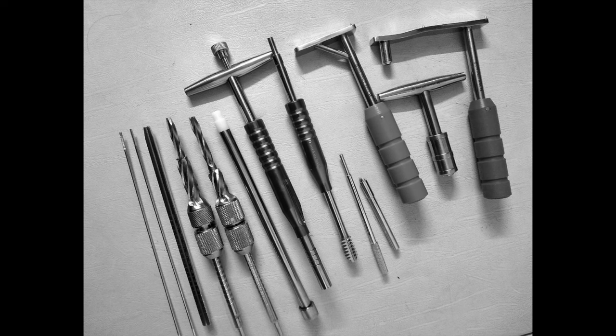Hello friends. Some residents had requested a video on the instrumentation of dynamic hip screw. So in today's video I will be showing you all the instruments that are required for dynamic hip screw placement and their usage.